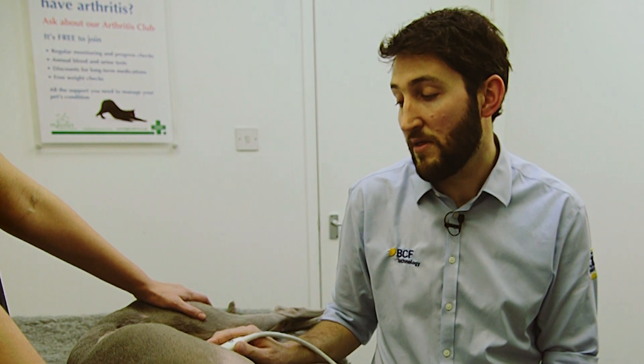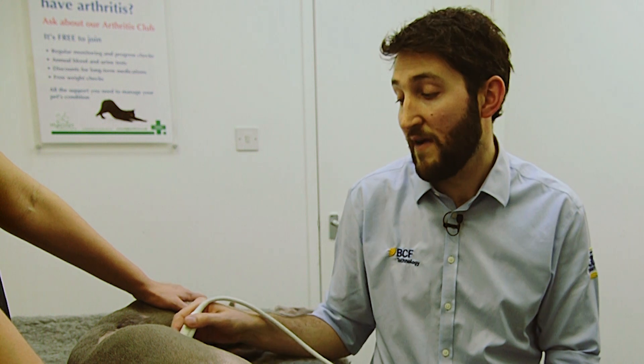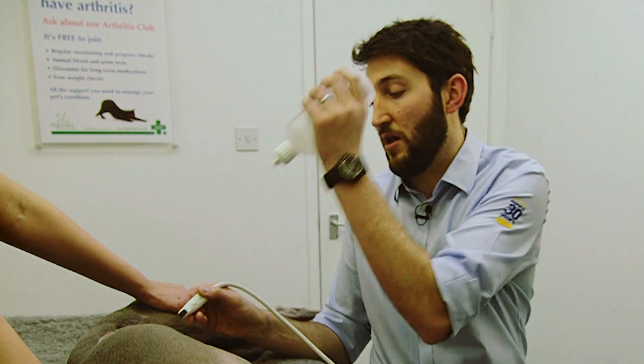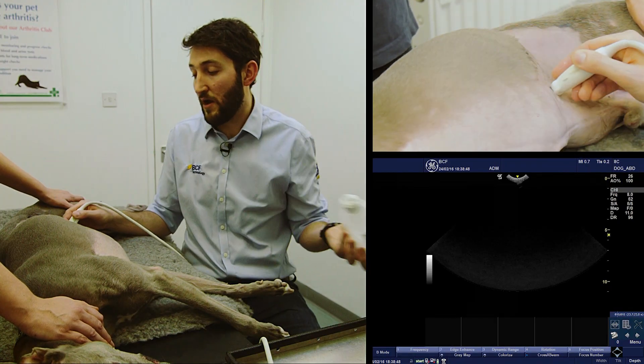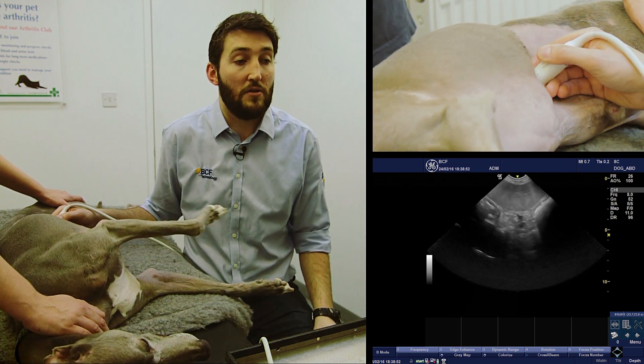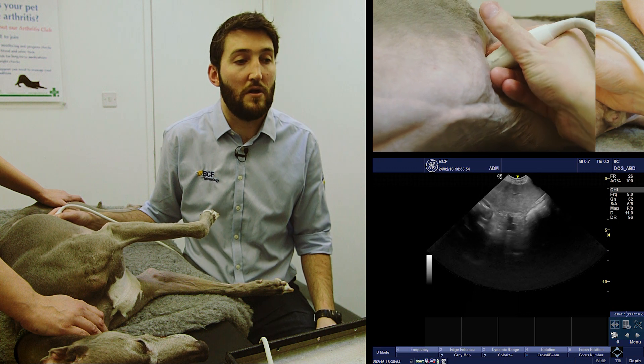We're going to start with the probe in a longitudinal plane — somewhere between sagittal and dorsal — with the probe at 90 degrees to the body wall, starting just caudal to the costal arch. After applying gel for decent contact, we're going to find the spleen and then come up the body wall following the costal arch.